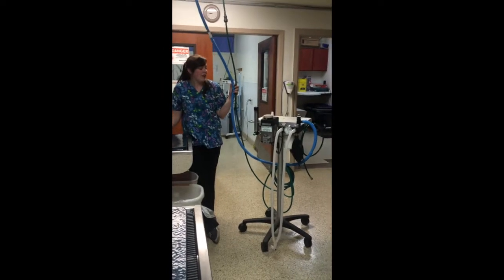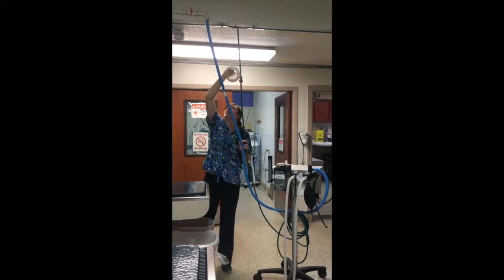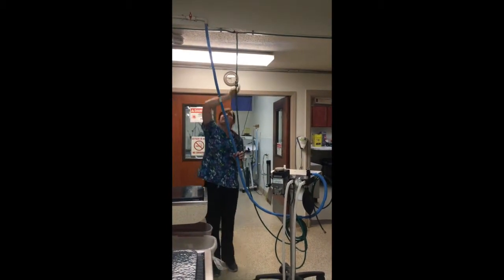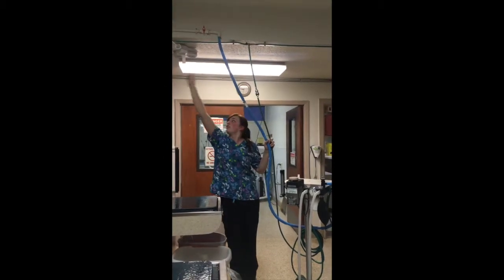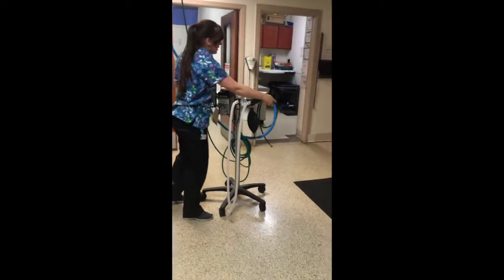All right, I'm going to be describing our rebreathing system. So first off, we have our oxygen line that's coming in here. This is delivering oxygen, which is then followed to our oxygen tanks, which live here in surgery. There's a line coming through the wall up down here. This is our scavenging system that's connected to tubing that directs it directly outside. So these two come down and connect. Your scavenging system connects over here.